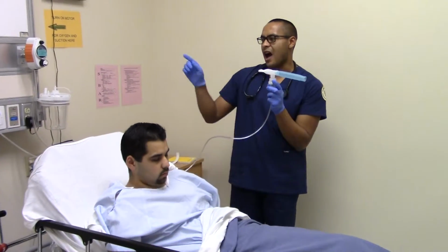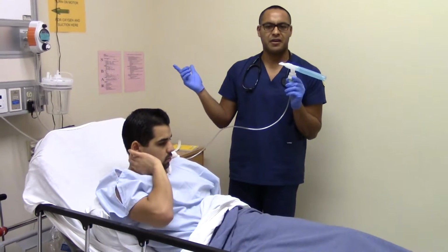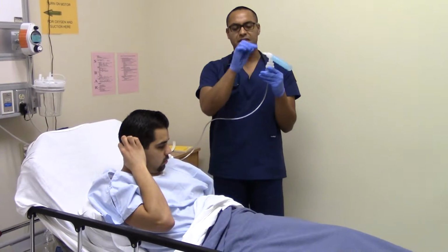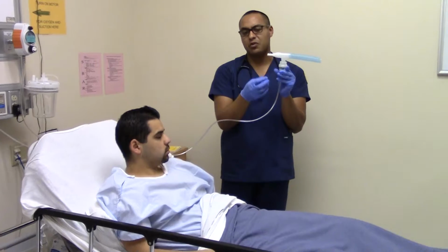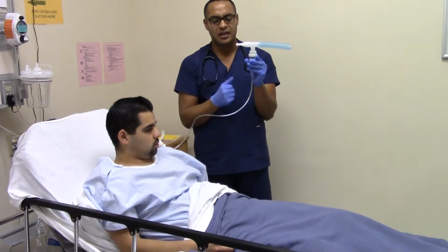Also, I would want to put the medication in the device before I turn it on. Put that on, have it off, put the medicine in here, then you start it up and check it. See aerosol gas coming out. It looks better when there's real medication in here, but you'll see gas coming out. It's really good.